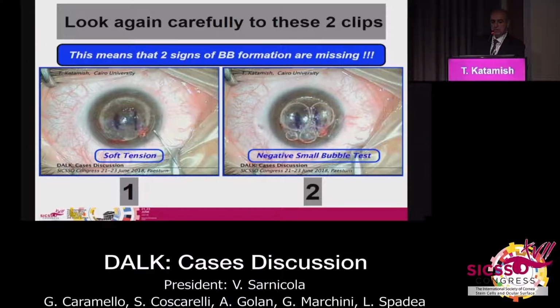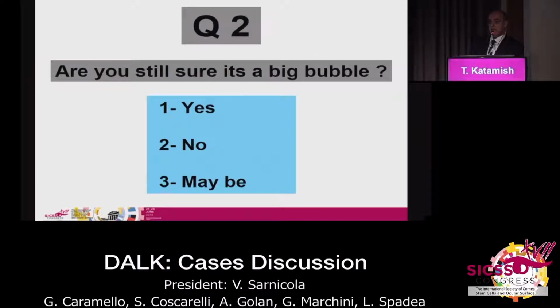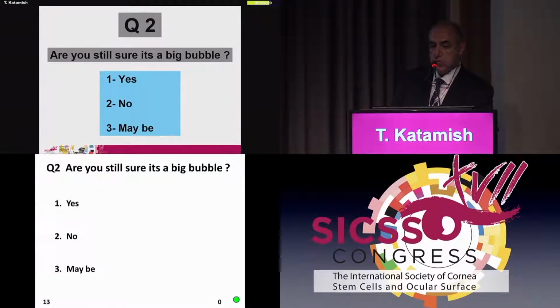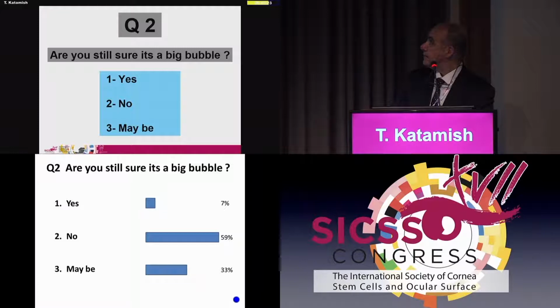So this means that two signs of big bubble formation are missing. So I will repeat the same question again. Are you still sure it is a big bubble? 1, yes. 2, no. And 3, maybe. So you are hesitant. You have now changed your mind, and most of you said it is not a big bubble.